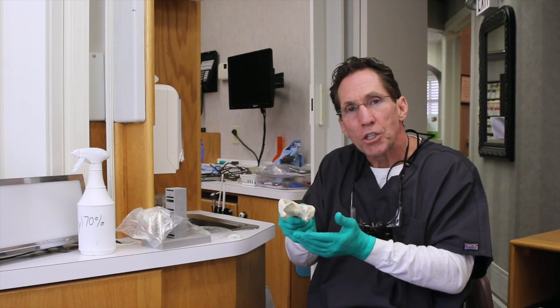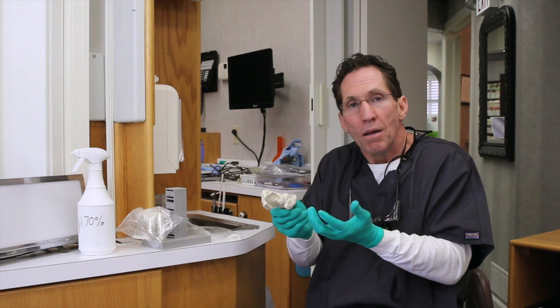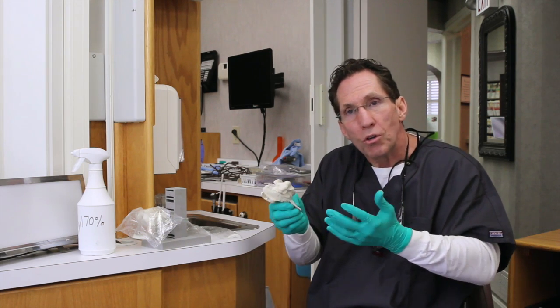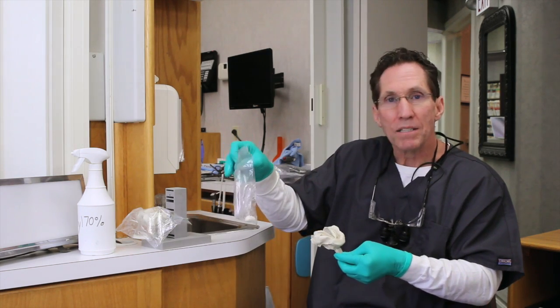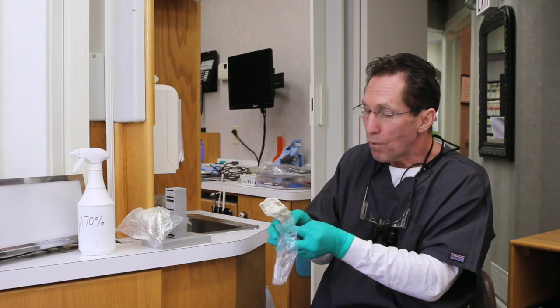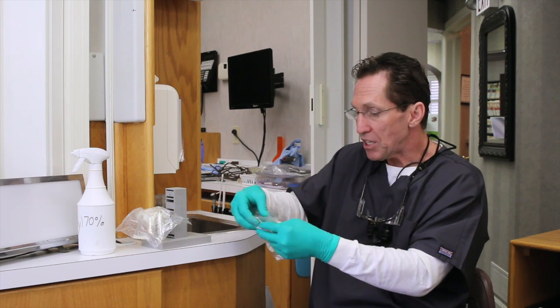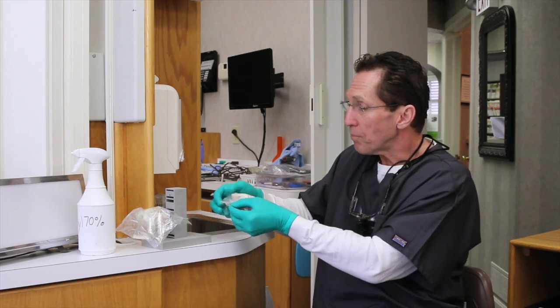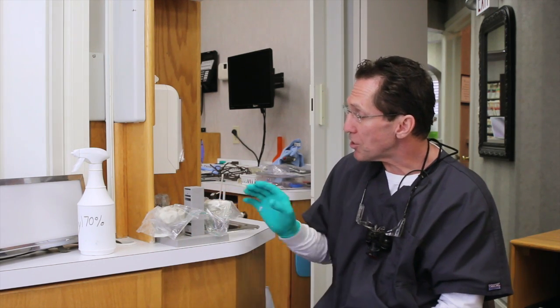And the best thing you can do to assure that the impression does not either shrink from dehydrating or expand from imbibition is to keep it in a humid, neutral or humid area of storage. And what we do is we use these little sandwich bags, these little Ziploc bags with a cotton roll saturated with water. We will place the impression into that bag. I don't even completely seal the bag off. I will kind of put it in there, and then I will store it on our little impression tree here. And then we'll take this to the lab, and we'll go to the pouring stage of the impression.